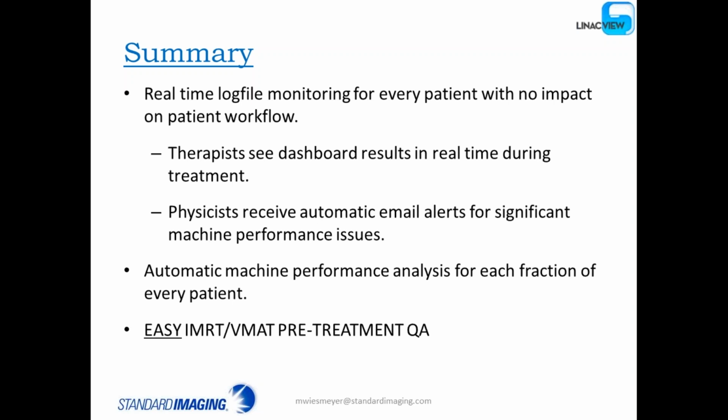And then at a later time, if you want to do it that way, you can have the physicist look at it perhaps during weekly chart checks. So it's a very low impact kind of system. And I know when I was working as a clinical physicist, if there was anything that impacted the workflow, it was really hard to sell it or hard to get it.